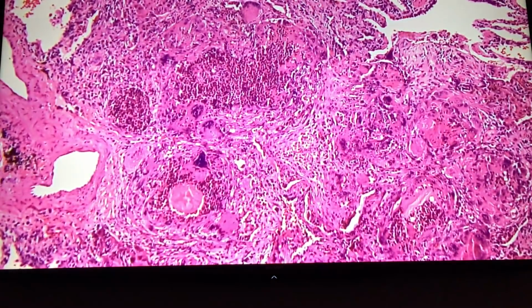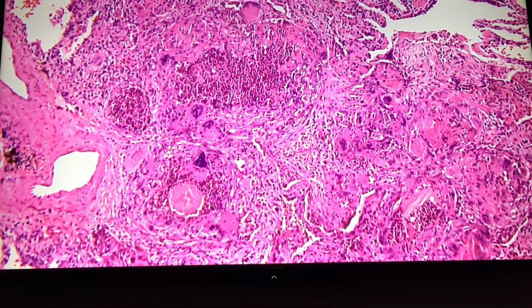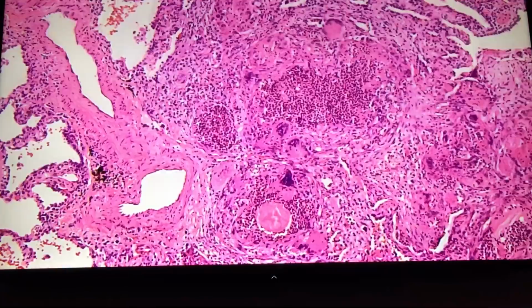So I'll tell you, in this field there's a finding that is absolutely pathognomonic. It tells you what the diagnosis is. It's slightly out of focus, Aaron. Within one of the suppurative granulomas is like an eosinophilic ball of material. Bring it into the high mag, Aaron. You know what he's talking about? Yeah, that.